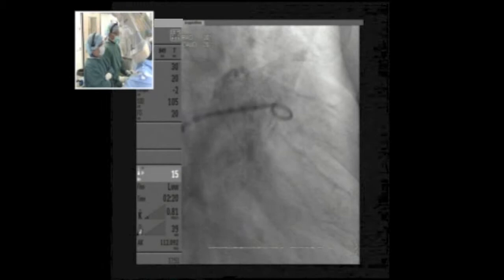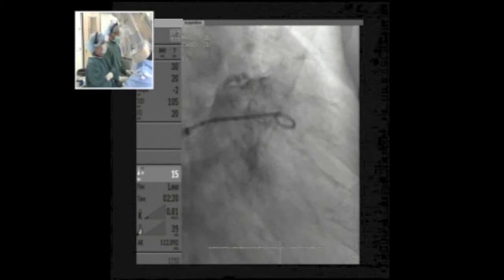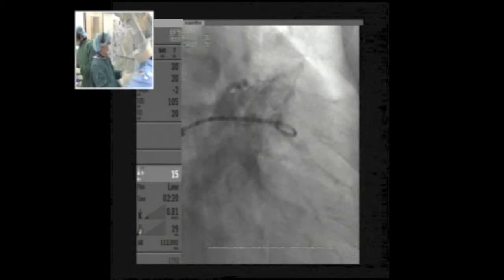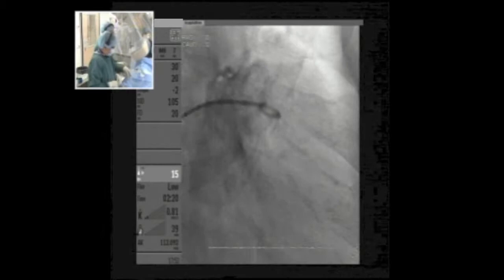The RAO caudal view is very useful if you want to manipulate your catheter from one position to the other — it clearly separates all the lobes, so it tells you where your catheter is. In the cranial view, it may be useful if you deploy the device more proximally because it makes the neck appear longer. However, in that view the lobes are overlapping so you don't know where the tip of the catheter is.